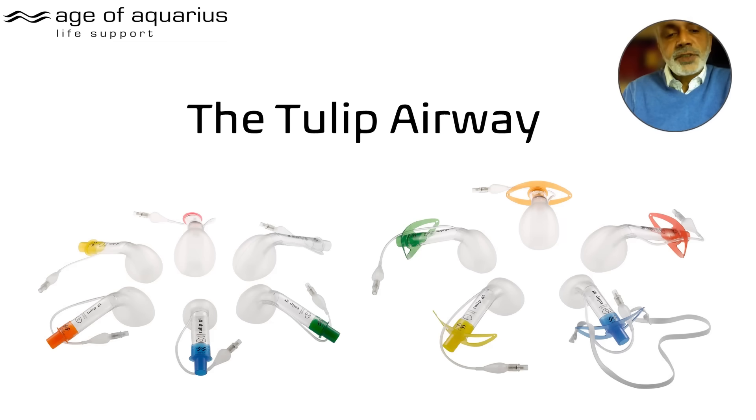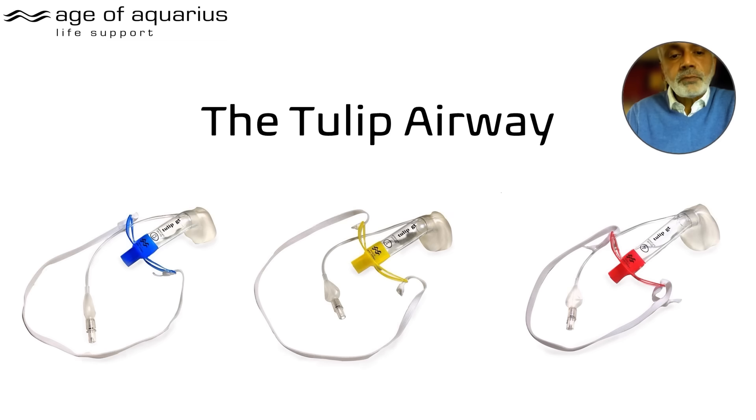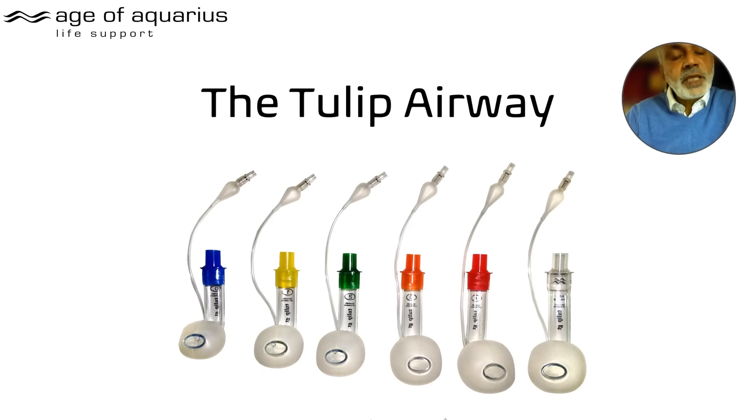As a quick recap for those who haven't seen the first videos: the Tulip comes in two types. On the left is the basic version with a straightforward connector; on the right is one with a lip guard and headband — optimal for military, ambulances, and the like. There are different sizes: blue is pediatric five to ten years, yellow size one is ten to fifteen years, green size two is adult female, orange size three is adult male, and red size four is oversized.